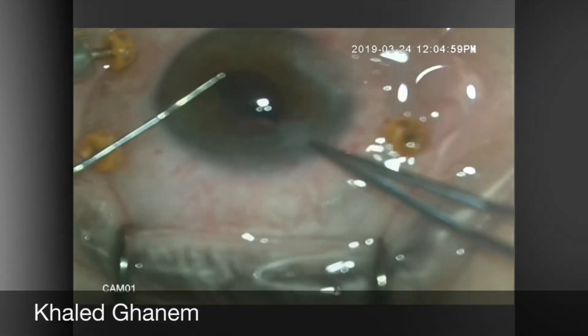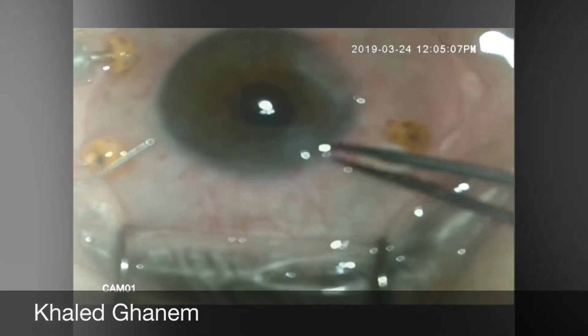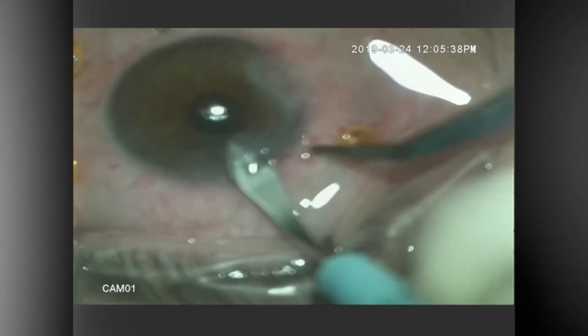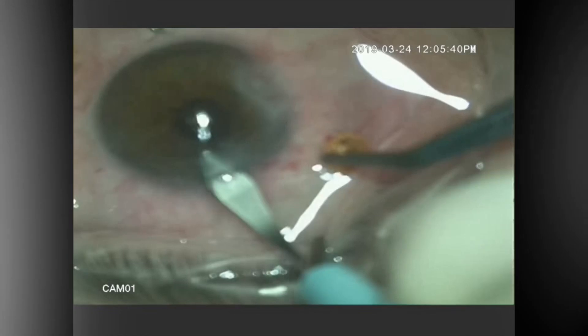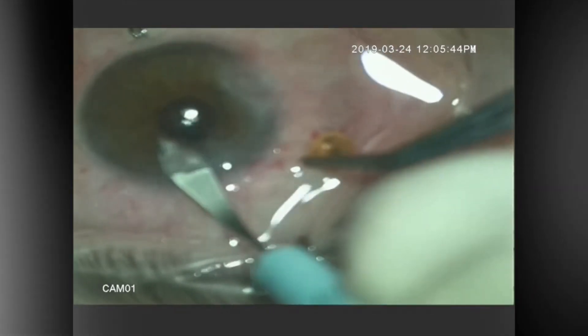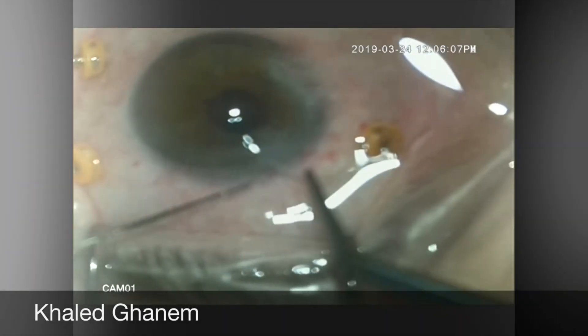Then with the McPherson forceps, the haptic will be caught, exteriorized out of the wound, and the IOL will be kept at this level. The wound is then extended and the IOL will be explanted easily out of the eye.